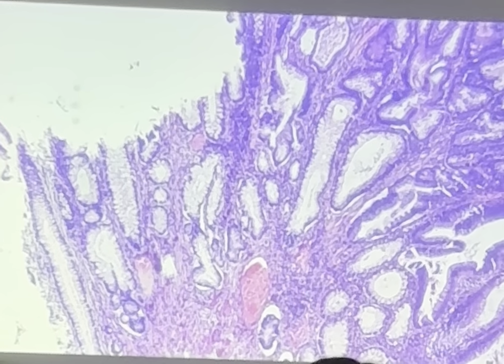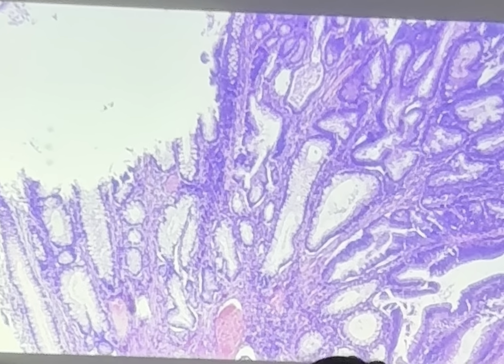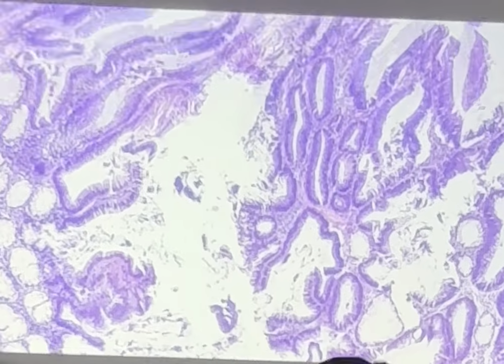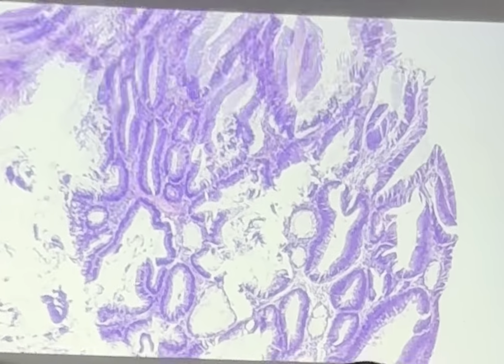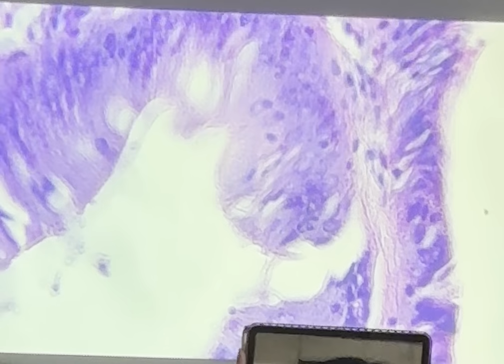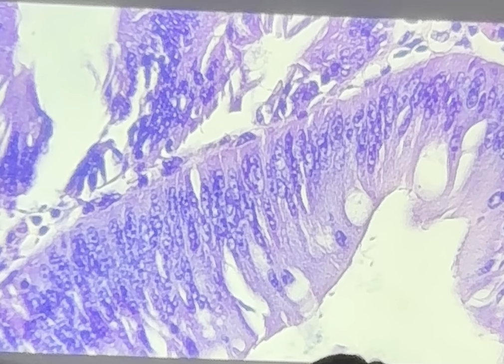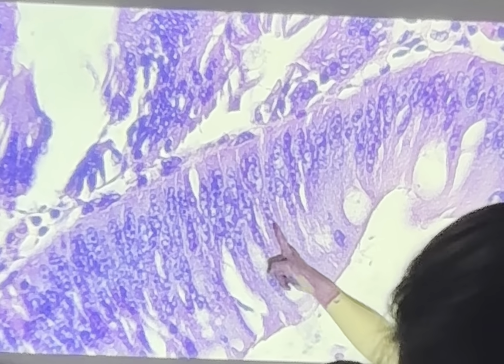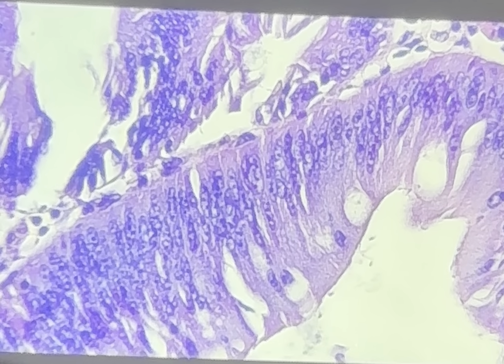But they have evidence of dysplasia. But it's not invading into the surrounding lamina propria. So, tubular adenoma, which carries a slight increased risk for colon cancer. So that's why you have to remove these polyps. Let's look at this one. Ooh, look at this one. Really, they're really stratified. And they're starting to become a little bit elongated instead of the nice oval appearance. That's what we call pencillate. It's like a pencil. Those are signs of dysplasia, because the normal nucleus is supposed to be round.